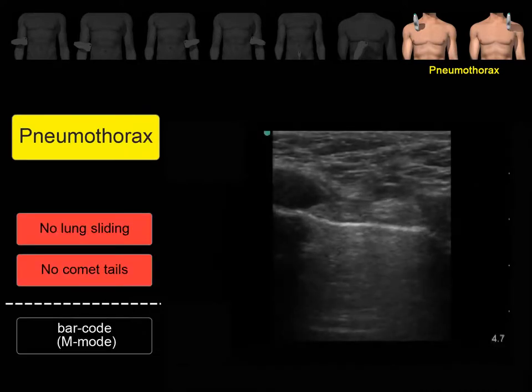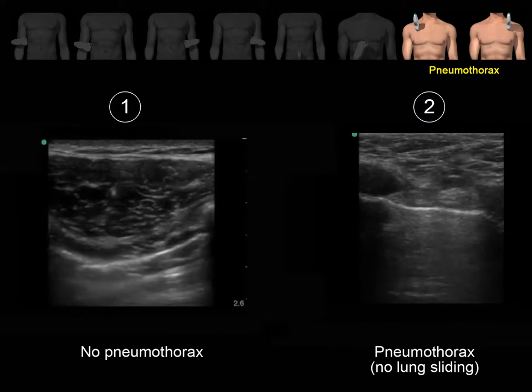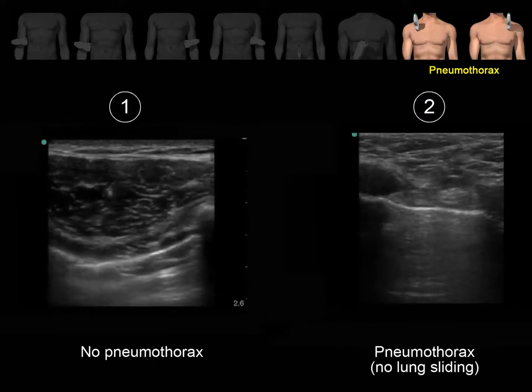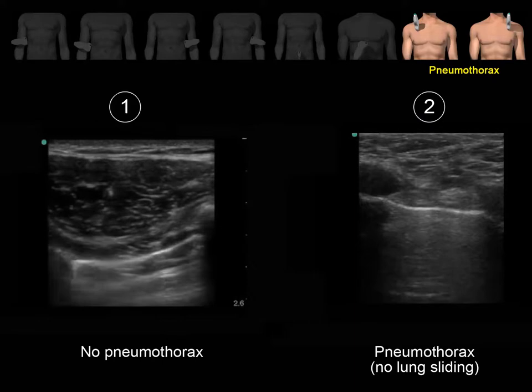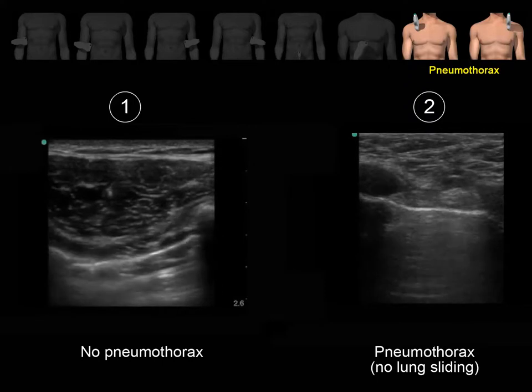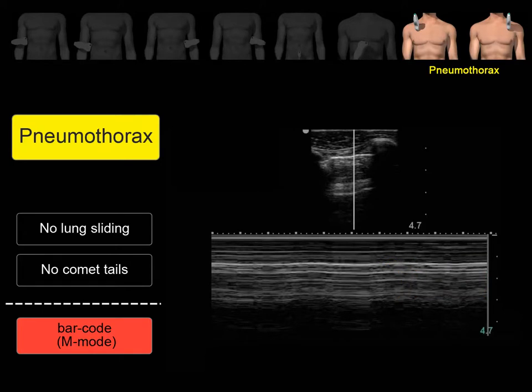The signs of pneumothorax are the absence of lung sliding and the absence of comet tail artifacts. In clip number one, we can see nice sliding movement in the pleural line and comet tail artifacts — this rules out pneumothorax. In clip number two, we don't see sliding movement and we don't see comet tail artifacts, indicating the presence of pneumothorax. The M-mode will show a barcode pattern, indicating air between the parietal and visceral pleura, as compared to the seashore pattern seen in normal lung.